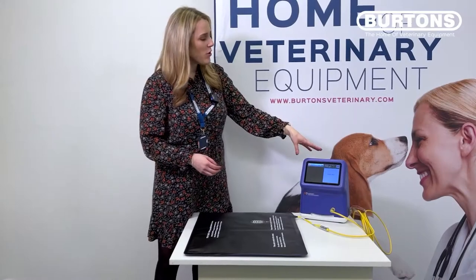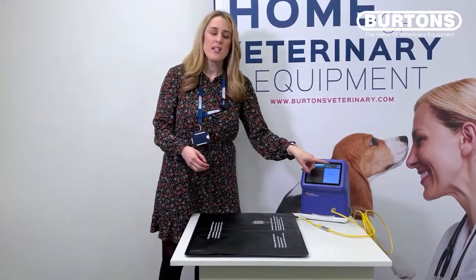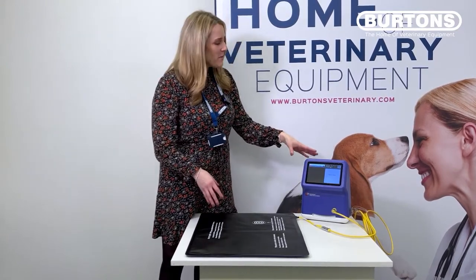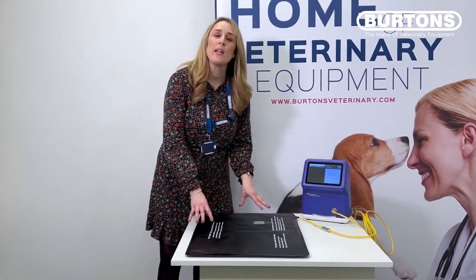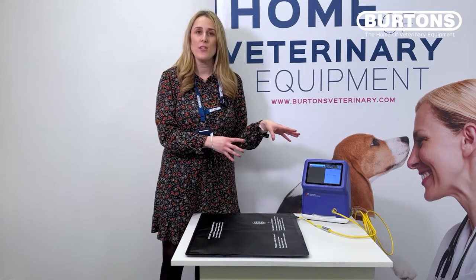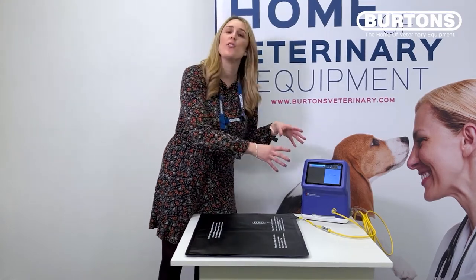With our patient controller, we've got a 7-inch touchscreen which allows us to individually manage each blanket that we have attached. This system only serves one blanket; however, one of our other models allows you to plug four different blankets into the unit and manage them individually on the screen — really good for a busy recovery area or a busy hospital.